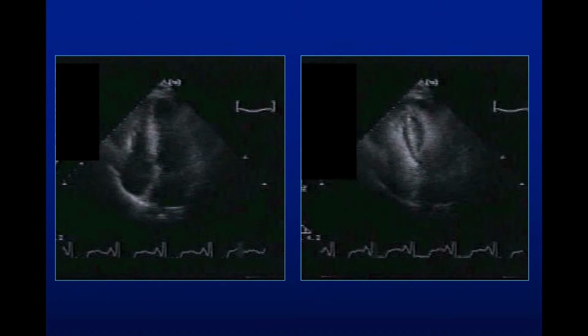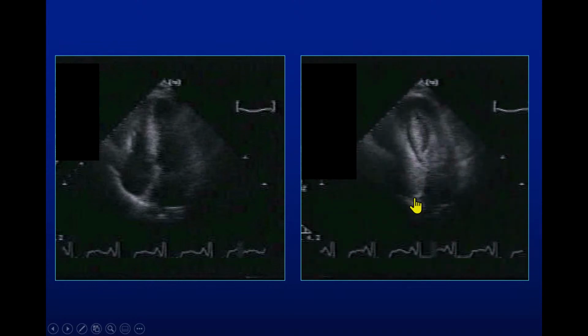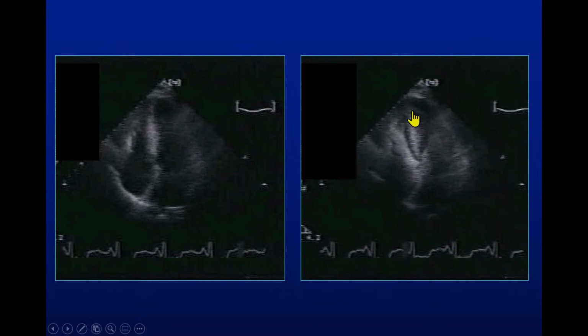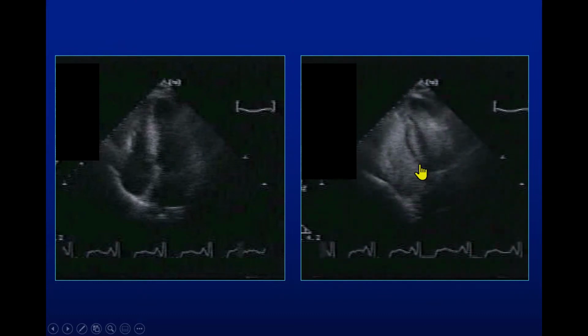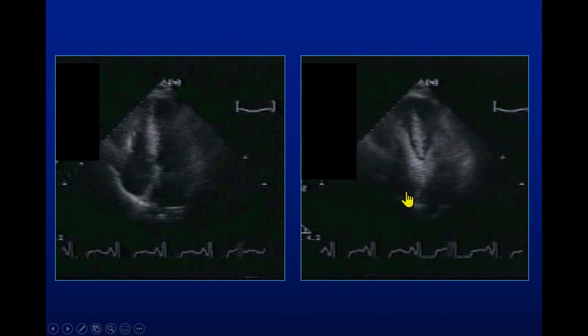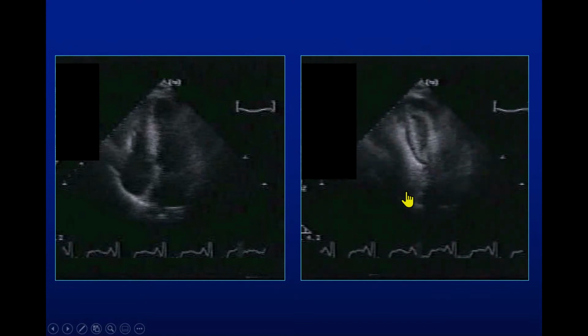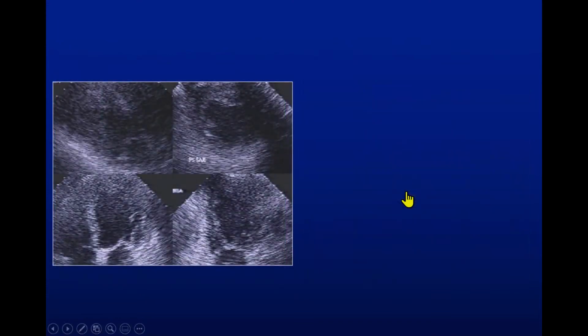And notice here in this situation that indeed this heart has a hypertrophic cardiomyopathy with a septal prominence, and the apex is not sequestered, actually is functioning very well. So a major change in your diagnostic capability, and basically if you don't see, you're going to end up with a lot of question marks. If you see it correctly, then you can make a diagnosis and give the appropriate diagnosis. Take a look at this case here.